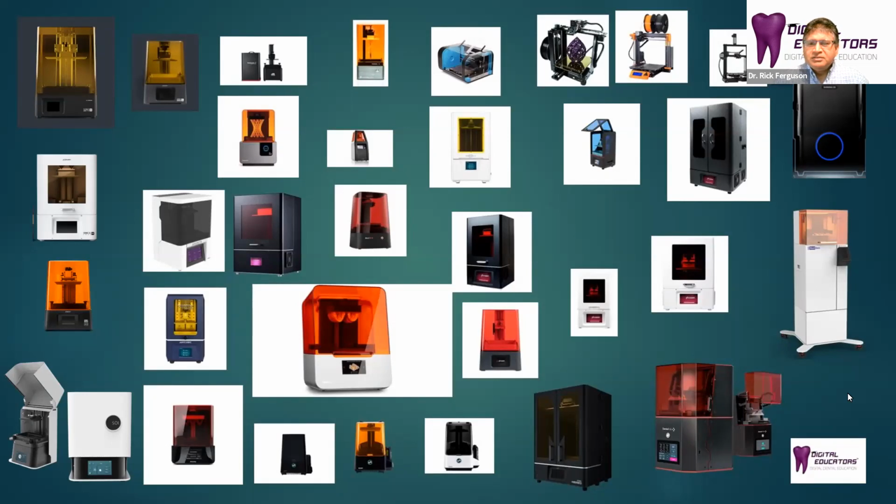So what I'd like to do today is actually answer some of the questions that we get in that group. There are a lot of different 3D printers, just a ton of them on the market now. And people go to that Facebook group and want to know how to use them, what the parameters are, what the settings are, which ones can be used for what, which resins work with different printers. And some of these printers are open and closed.